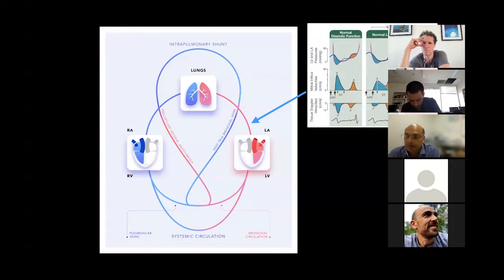If you talk about the TR Vmax, patients on a ventilator will have an artificially elevated afterload of the right ventricle, which can affect the tricuspid regurgitation. Volume status again will affect it. The loading conditions will affect the tricuspid regurgitation. Patients in ARDS, hypoxia will affect it.